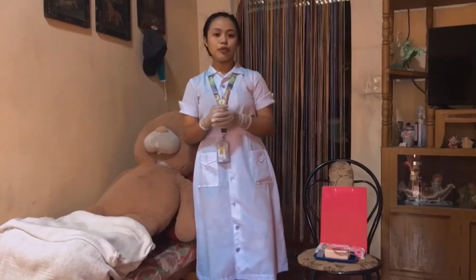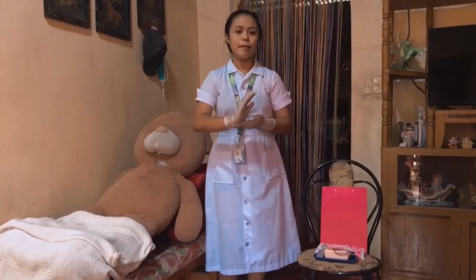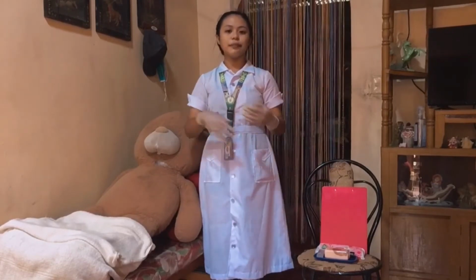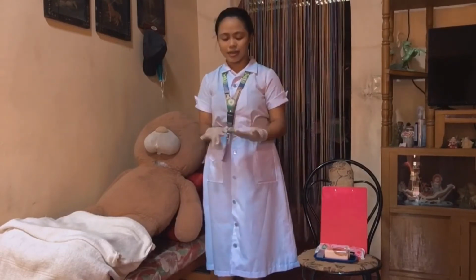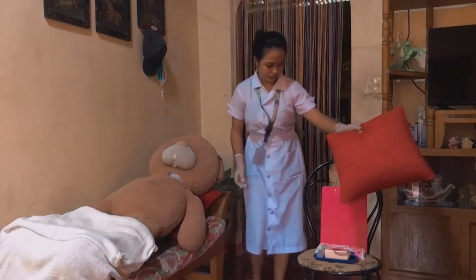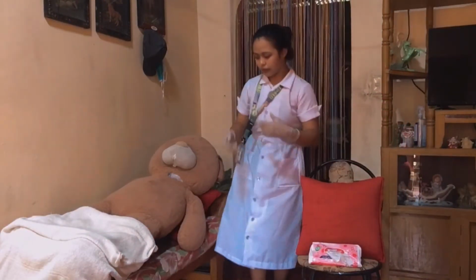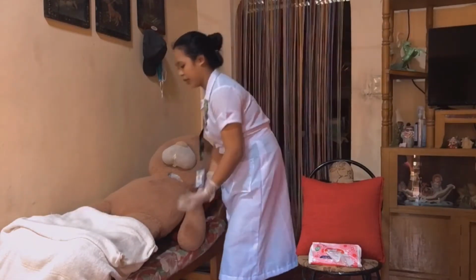Now we will proceed with removing the bedpan. When removing the bedpan, return the bed to the position used when giving the bedpan. Hold the bedpan steady to prevent spillage of its contents, then cover the bedpan and place it on the adjacent chair. Tatanggalin ko lang po ito. Sir, tatanggalin ko na po yung bedpan. Okay po ba yun?